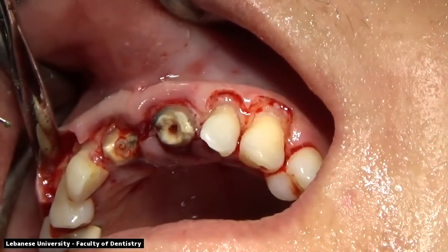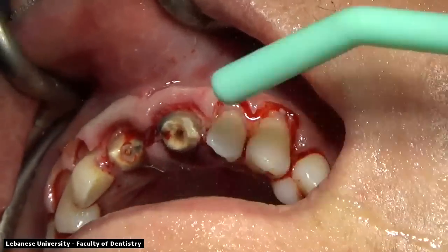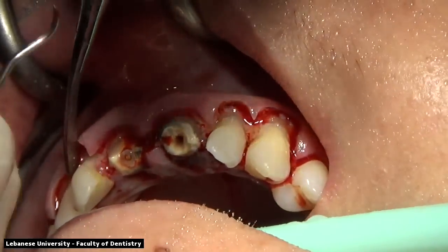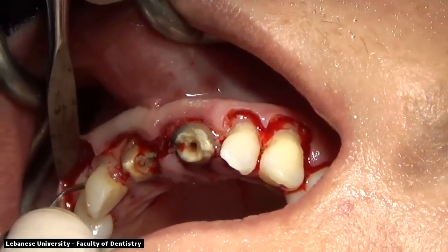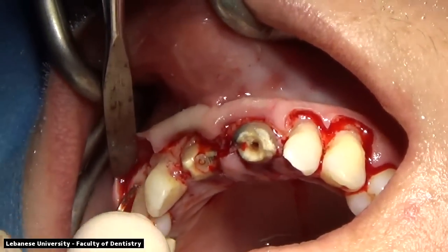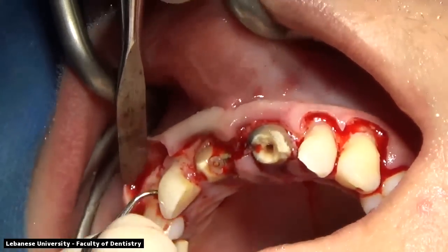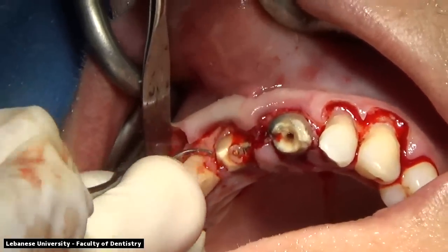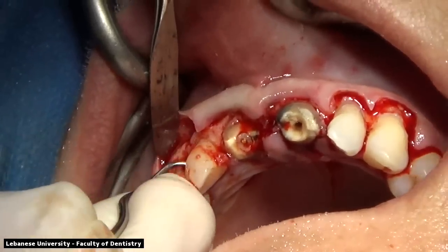The rounding of the margins is very essential, and scalloping of the margins is very essential for adaptation of the flap later on. Again, we're doing some root planing of the roots and removal of any granulation tissue, as well as adjusting the bone levels and making them flush and knife edge to the surface of the roots.